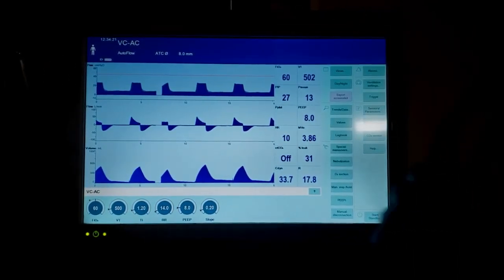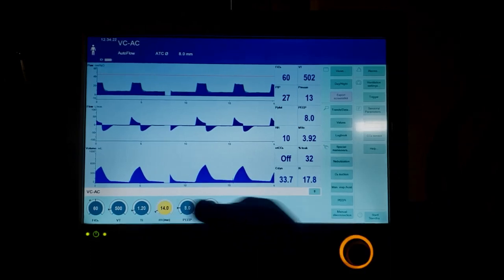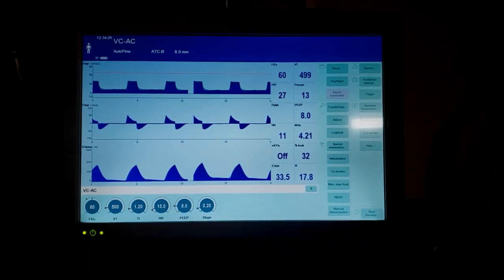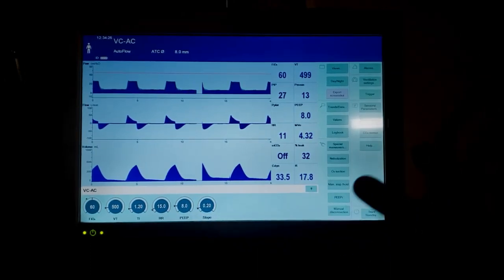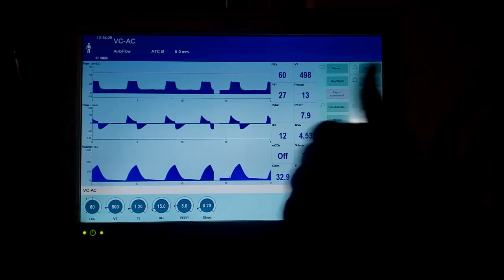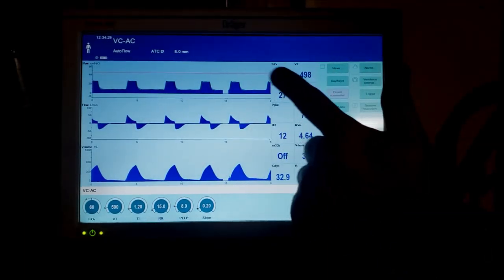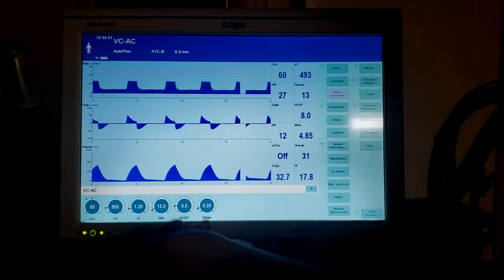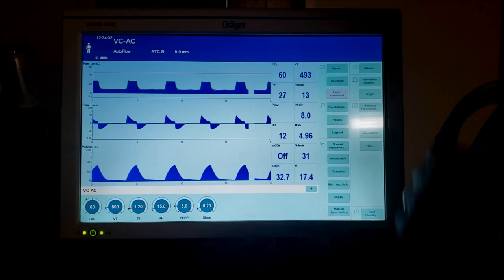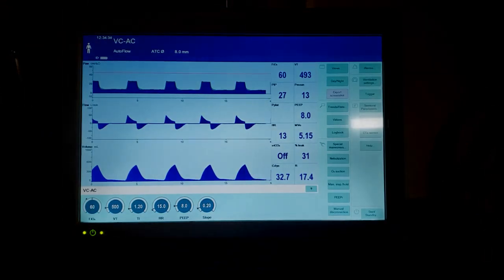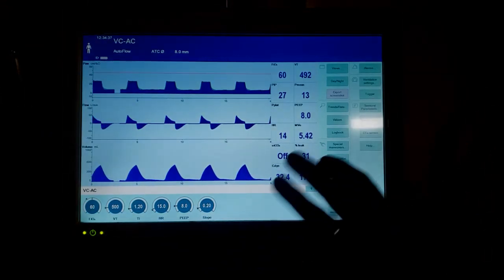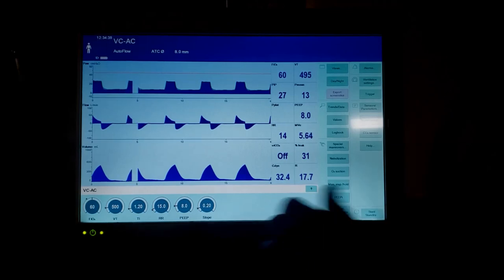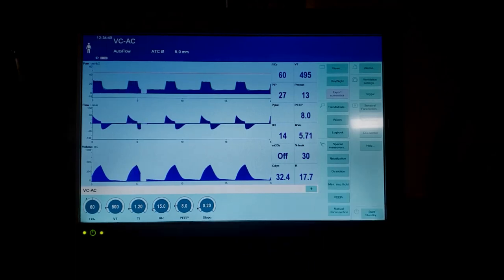If we're going to adjust rate, obviously right here. Two things that can affect somebody's CO2 to take it down: respiratory rate and tidal volume. By increasing rate or tidal volume, you're going to decrease their CO2 and help their pH. Tidal volumes we like to have, like I said before, 8 to 10 milliliters per kilogram ideal body weight. Respiratory rate is usually 12 to 20.